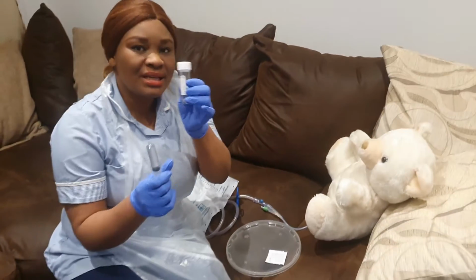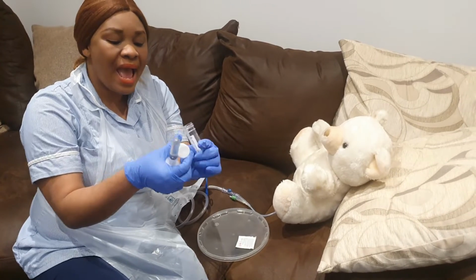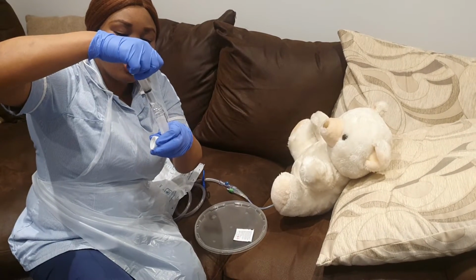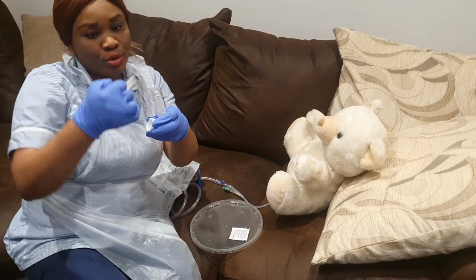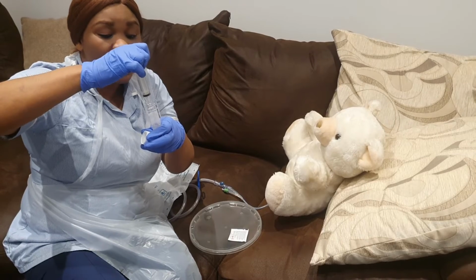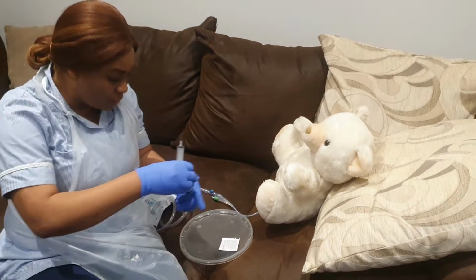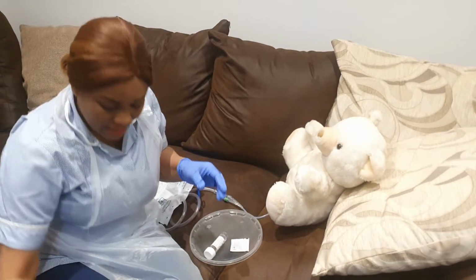So I'm now going to get my sampling bottle. And I'll pour the urine into my sampling bottle, making sure that the tip of the syringe does not touch the inside of the sample bottle. So you pour your urine into the sample bottle, making sure the tip of the syringe does not touch the body of the sampling bottle. So I've gotten my sampling bottle. I'm just going to close it now. All right, and the syringe is going to go into the clinical waste.